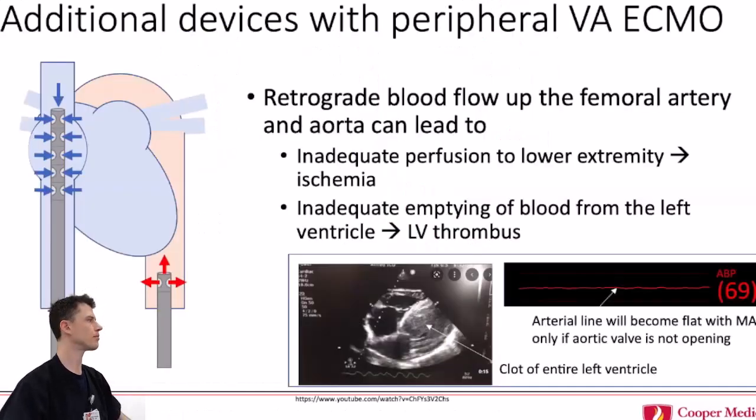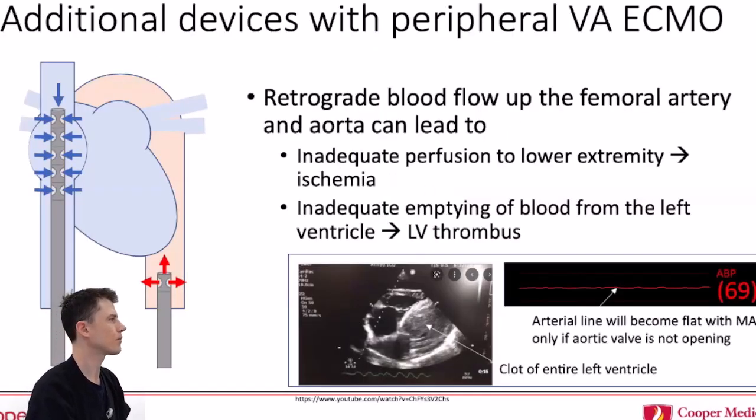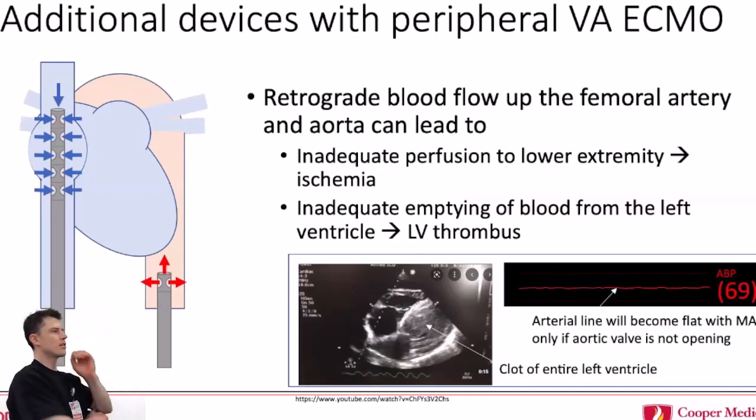I have a question. I know we don't deal with kids, but why is the cannulation different with children? Is it because of the different vasculature? I think the vessels are small. Yeah, the vessels are small, access is a challenge, and it's just the way it's been done for a long time. They do really well. They don't have carotid disease like an adult does. Exactly. They're healthy, so it would be easier to just do it centrally, because those are larger vessels. A lot of them actually go to the carotid artery. They put that return cannula into the carotid artery, which in an adult would cause a stroke, but in kids they can ligate that off and there's no problem. They just perfuse their brain from the other side.